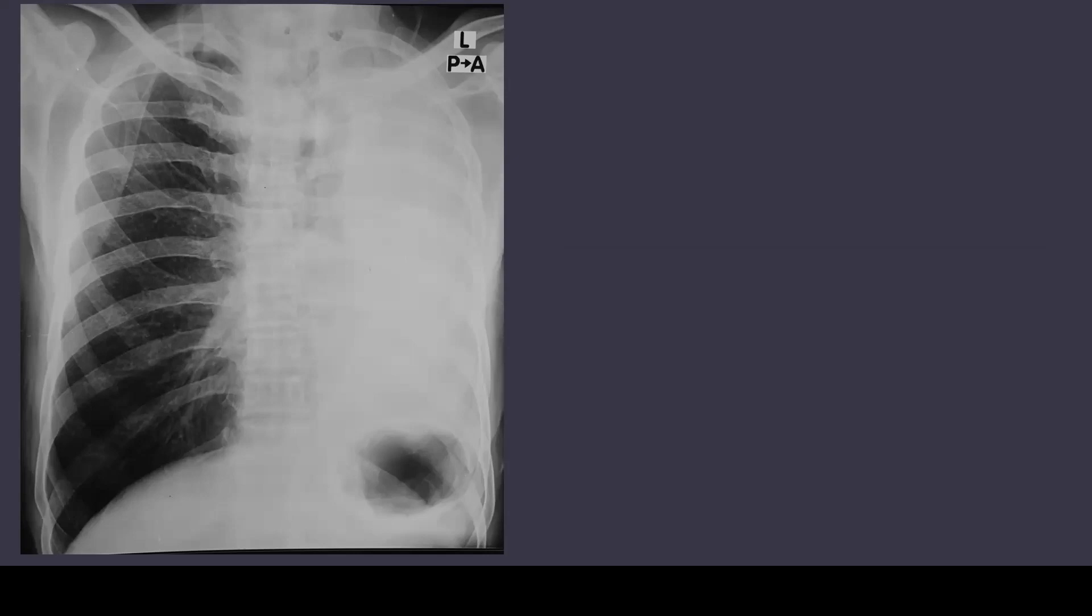This is a chest x-ray PA view showing opacification or whiteout of left hemithorax. As you can see on the left side, there is this white opacification.